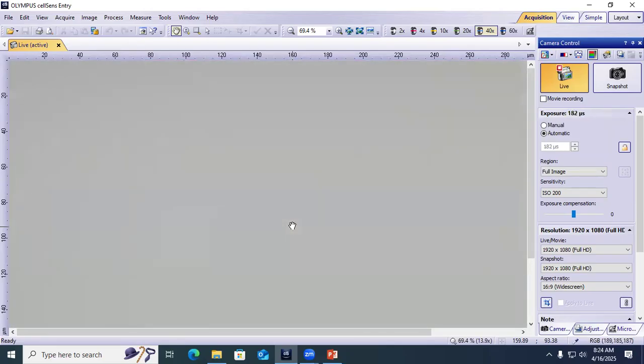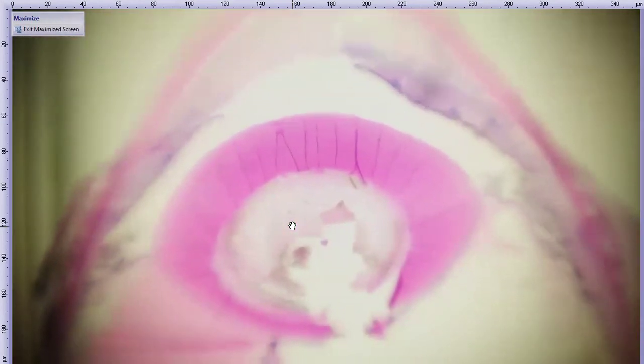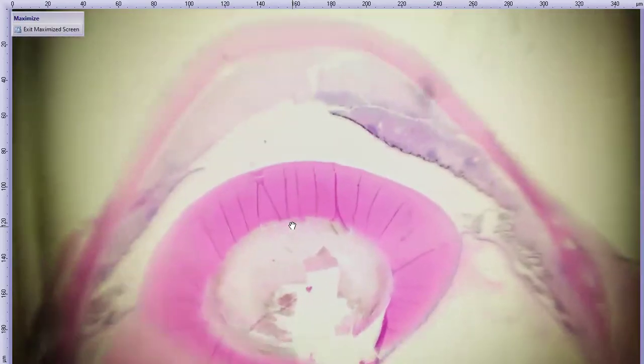So I guess I'll try to do a subgross. I'm quite bad at this, but maybe I'll learn one day. You had your practice. Yeah, I always avoided doing this though. It's really shaky hands. Also, it's not really focusing. Use fine focus. Do I really? Well, see, it goes to show how not often I do this. Here we go. All right. It's still pretty cloudy. But doing my best. Okay.